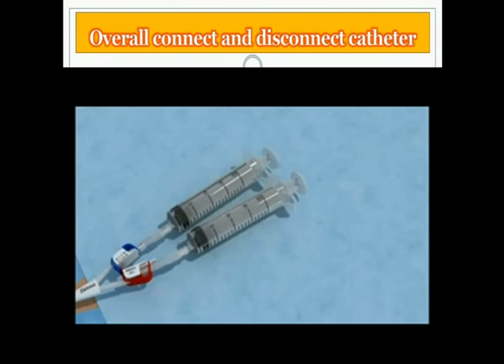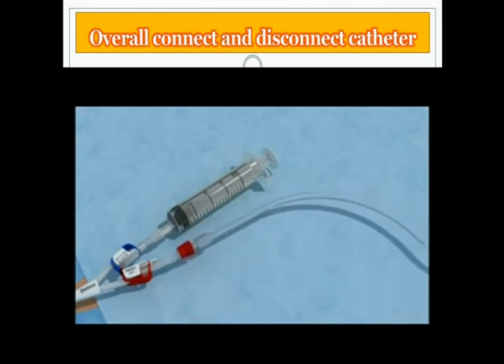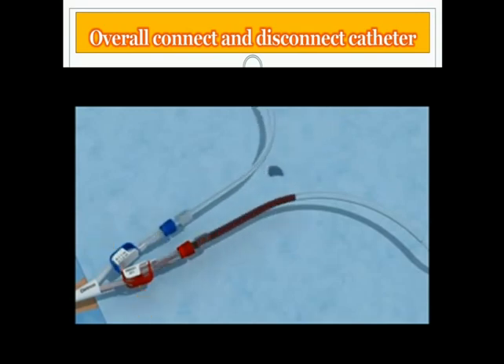Connect the bloodlines. Connect the arterial bloodline to the arterial lumen and remove the empty 20 milliliter syringe. Connect the venous line. Open the clamps and start the dialysis. Restore the patient to an upright position.